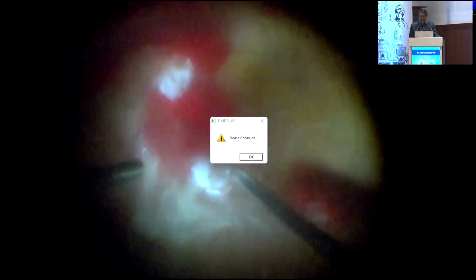And this is when you complete the surgery. So it makes it a lot easier.